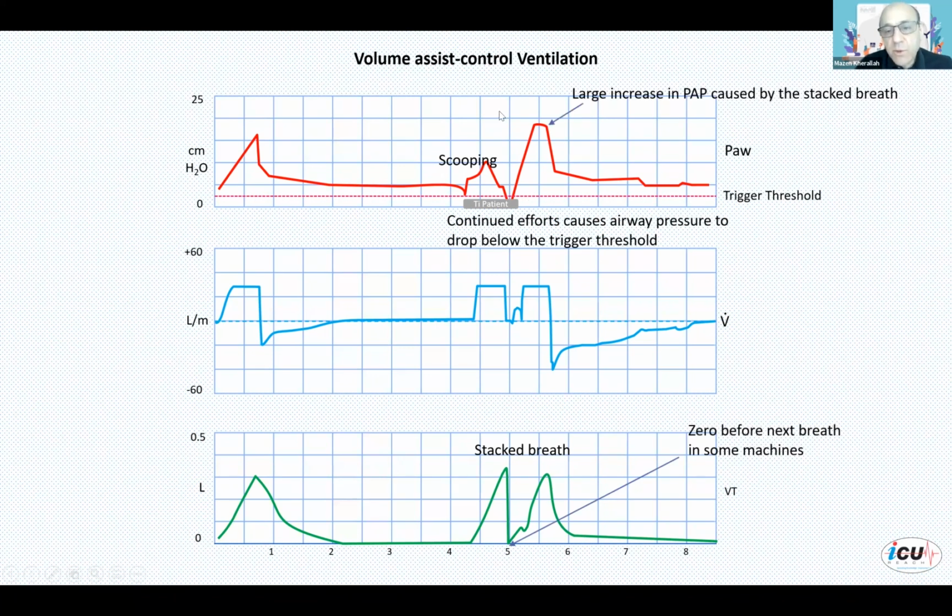And then you, of course, require higher pressure. So notice that the patient is not breathing anymore here. So he's not participating in the negative pressure anymore. The breath is already triggered. So the machine is going to utilize a pressure to keep the first air in, which is a plateau pressure, plus we need the pressure to deliver the second breath, and that's why the pressure is almost doubled. And the volume is doubled. You can see the second breath here. Of course, this is actually the patient's effort. So he tried to exhale at this point.